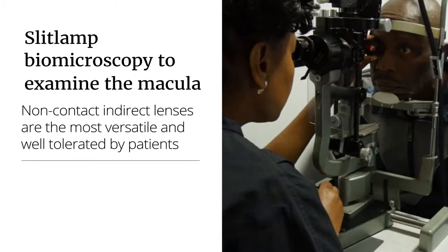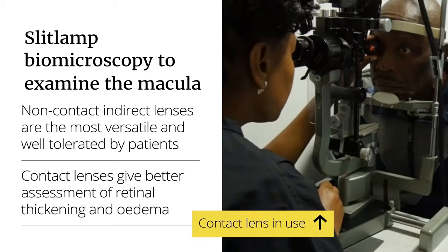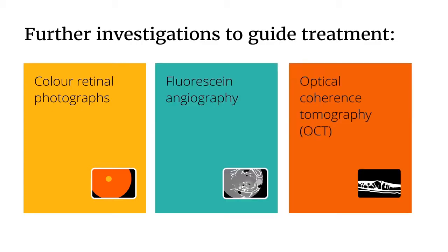Non-contact indirect lenses are the most versatile and well tolerated by patients. However, a contact lens will give a much better assessment of retinal thickening and edema. Further useful investigations to guide the treatment process include colour retinal photographs, fluorescein angiography, and optical coherence tomography, OCT.